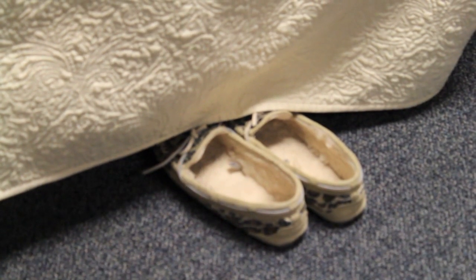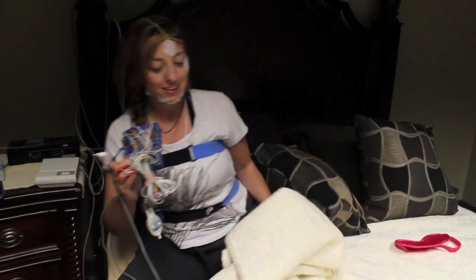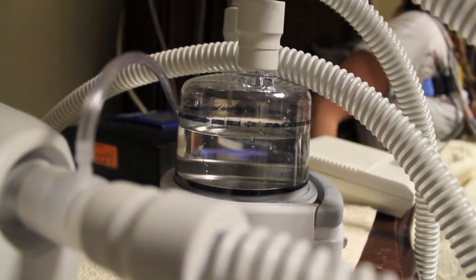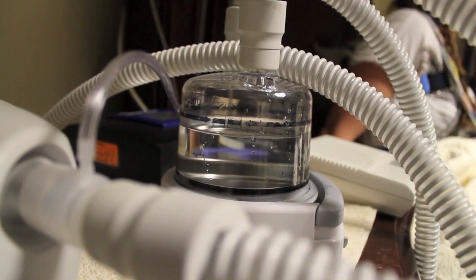The EEG that we're monitoring on your head — that's so that we can say when you go to sleep and what stage of sleep you're in. Bring anything with you that will make it more comfortable. Don't expect to wear jeans or something with a heavy waistband, but anything that you'd normally sleep in would be perfectly fine to wear for your sleep study.